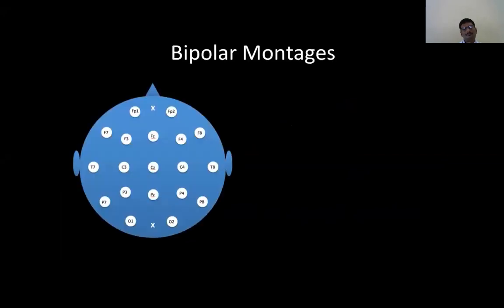The most common type of montage is a bipolar montage. Here I have a picture of the head from the top down.